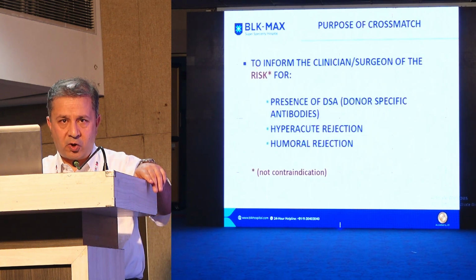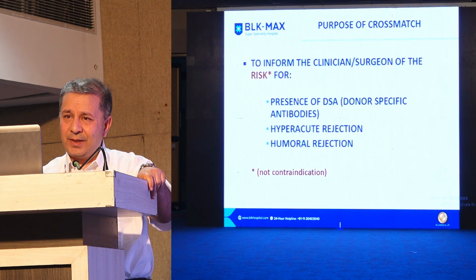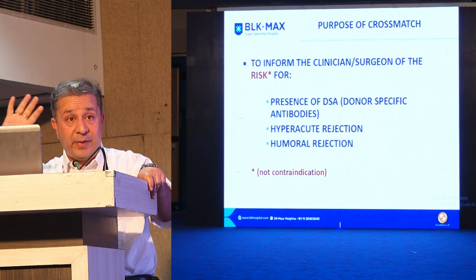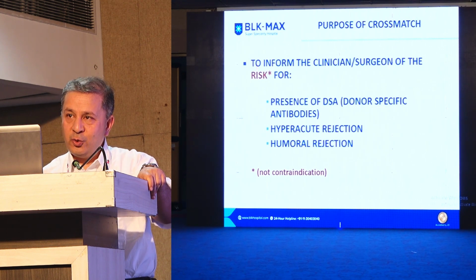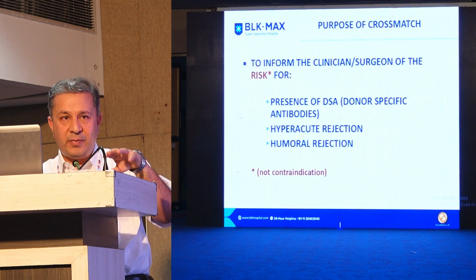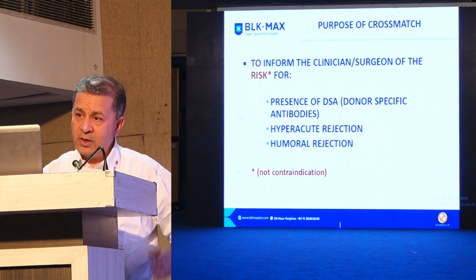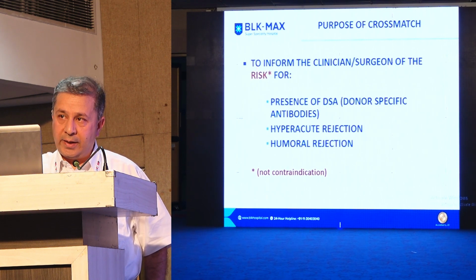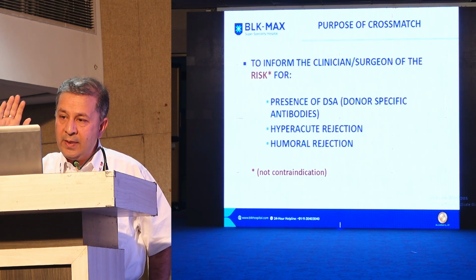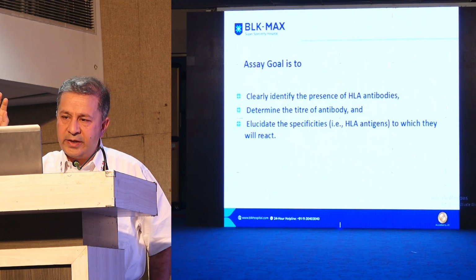So what is the purpose of a cross-match? The purpose of cross-match is not only to help you select the best possible donor in a circumstance where you have many donors, but even with the donor that you've already selected and you don't have a choice, you should already know upfront what is your possibility of having an event. That could be any event for that matter. So imagine we are only talking about the risk part of it. We're not saying it's contraindicated or you cannot do it. We're only telling you there is a presence of an antibody. And of course, we're also talking about which antibody against what and how difficult it is to treat. I'll not get into details of that.